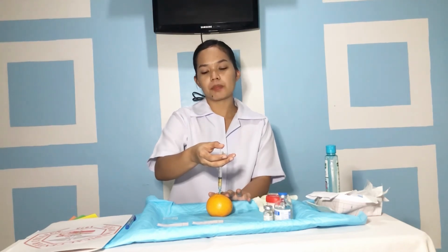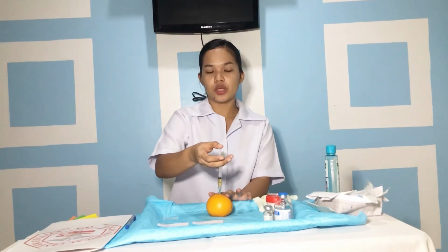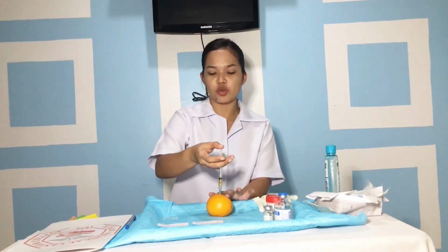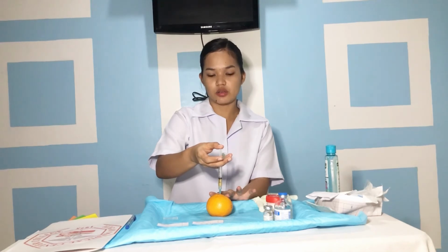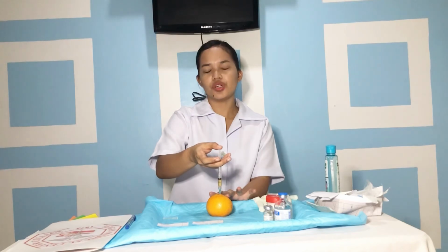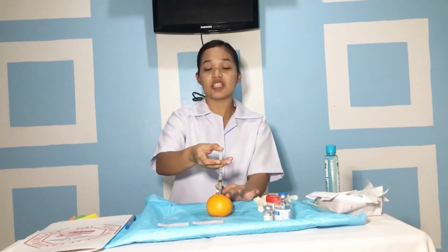So after the needle pierces the skin, grasp the lower end of the syringe barrel with the non-dominant hand to stabilize the syringe. So we continue to hold the skin tightly with the non-dominant hand, and then move the dominant hand to the end of the plunger. So do not move the syringe. Smooth, steady motion reduces pain at the moment of injection. So pull back the plunger. So if no blood appears, then inject the medicine slowly.